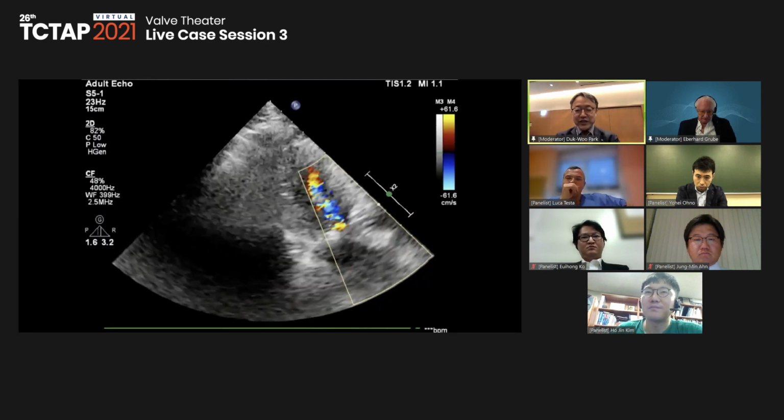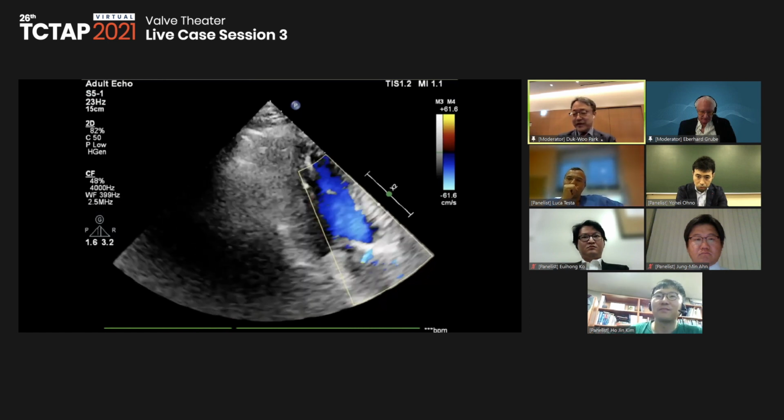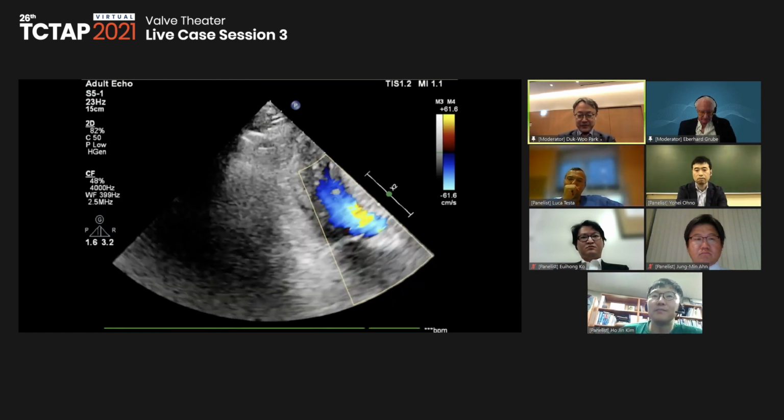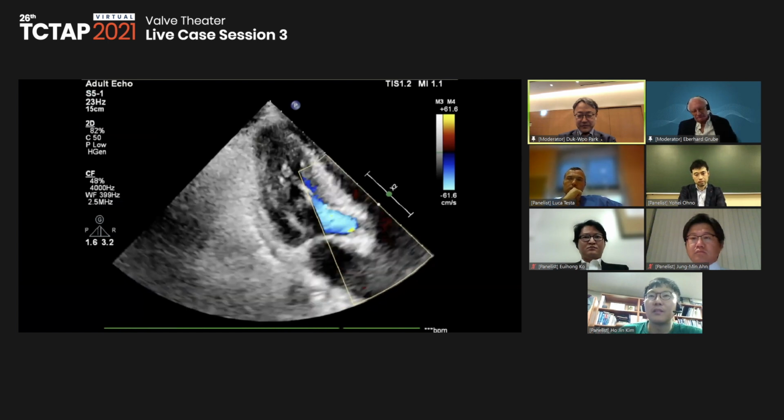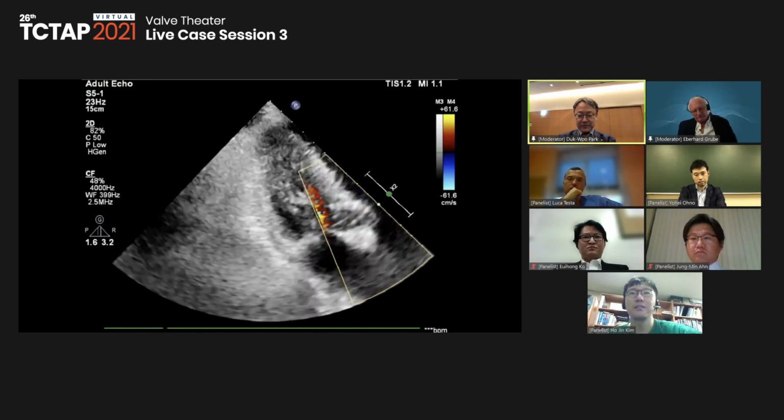This is a transthoracic echo. Yeah. 이거 에코를 보여줘야 되니까 에코를 좀 약간 너무 옆에 놓지 말고 중간으로는 못 놓나? 그렇지. 오케이, great. Over here.